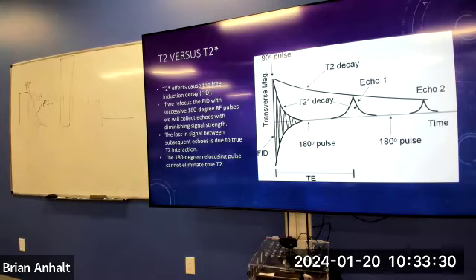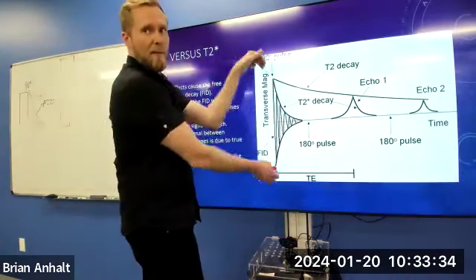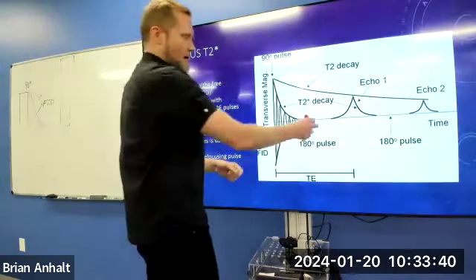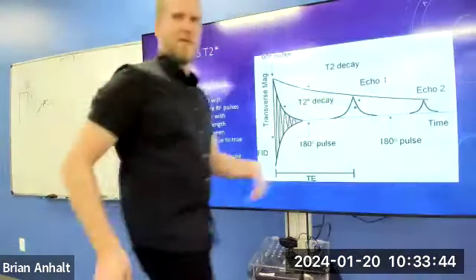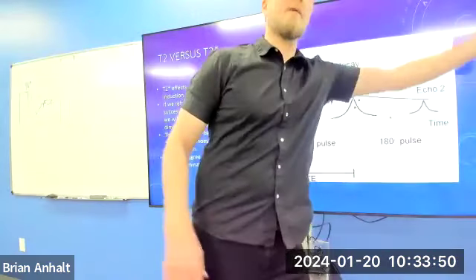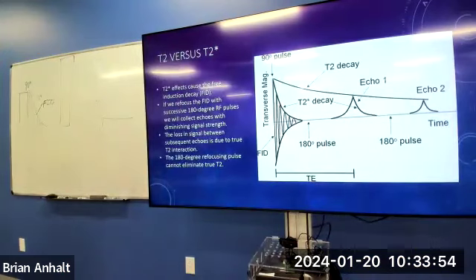So in reality, because of T2 star effects, our signal decays very quickly, rapidly. We didn't want to listen back to the signal yet because we want to wait for whatever reason. We'll get there. 180-degree refocusing pulse, put it back into phase. It goes back into phase, but not completely. Depending on when we do it, it's going to be less and less signal. If we wait forever, eventually we're not going to get anything to come back into phase because a lot of true T2 interactions happen to completely cause dephasing.